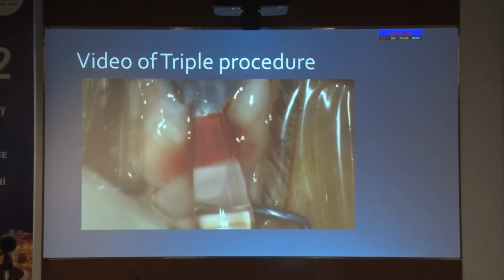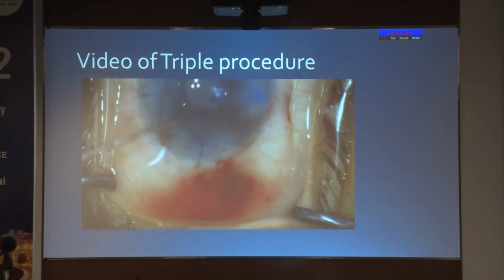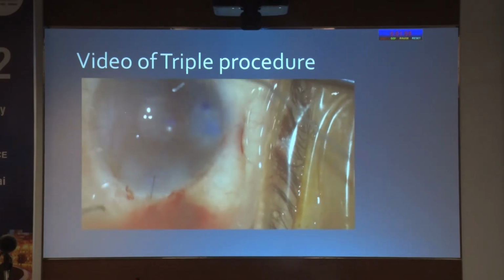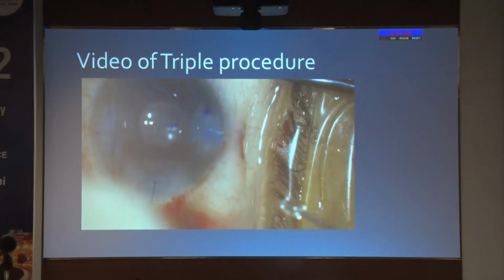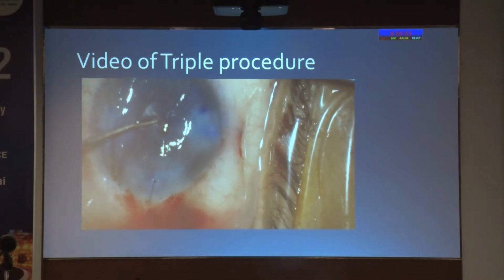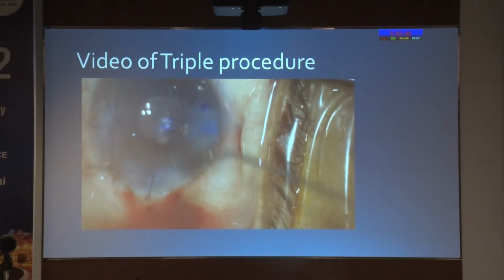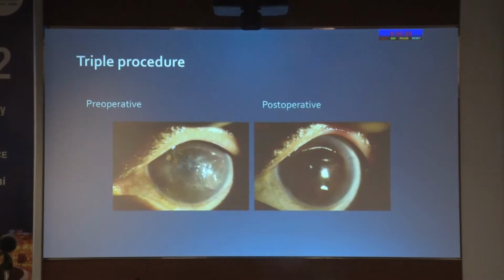As you must have seen, the donor graft was scrolled upwards, that is, the endothelium should be facing outward and there should be proper orientation of the graft. Tapping on the anterior corneal epithelium will help to stabilize the graft and help in proper positioning. Once we are ensured that there is proper position, we can fill the anterior chamber with air and ensure that the graft is in position. Suturing of the main entry wound is recommended so that there is no collapse of the anterior chamber.